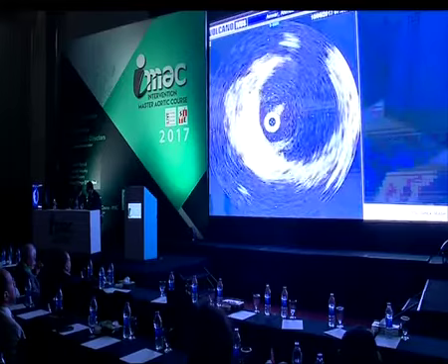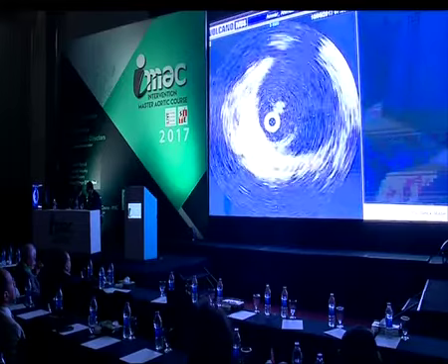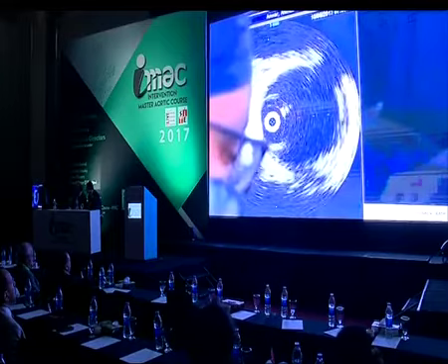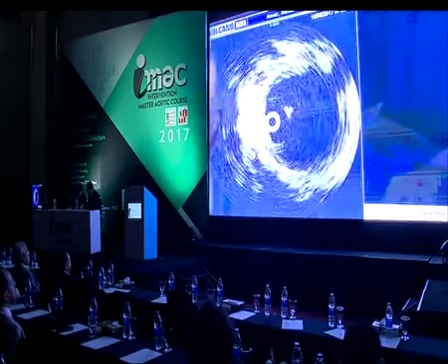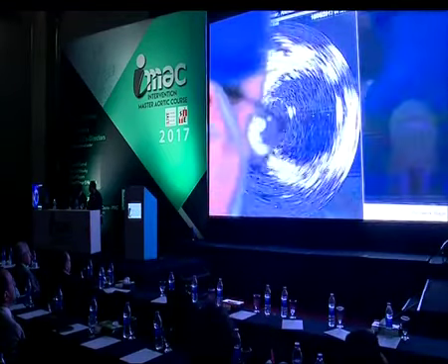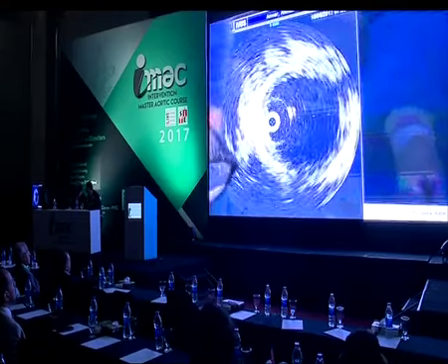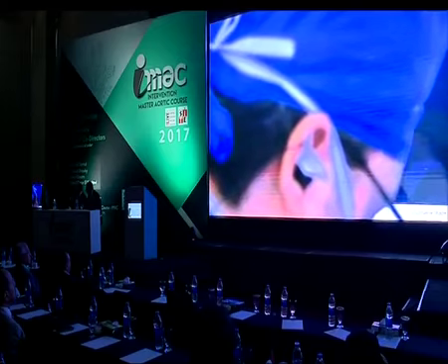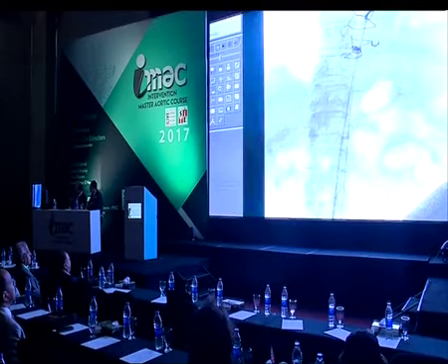You are rotating the IVUS catheter now? Yeah. So you are going to put a mark on your screen to mark the origin of the celiac artery to avoid covering it with your stent graft, right?